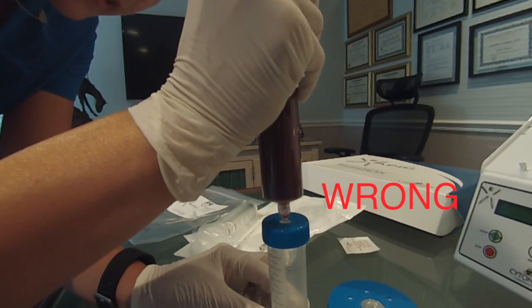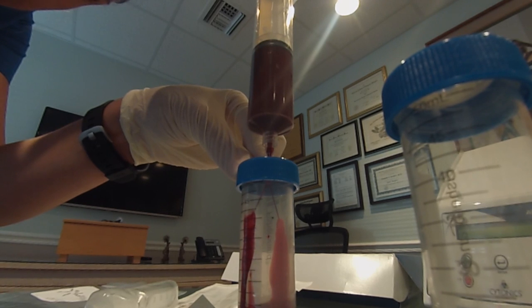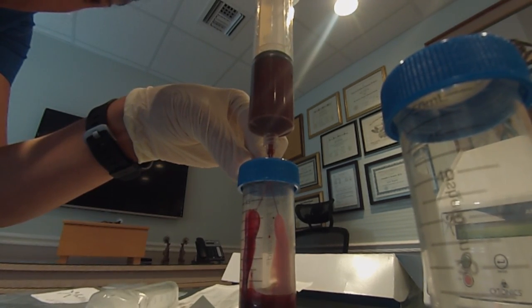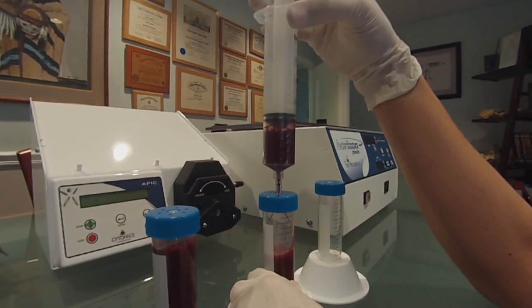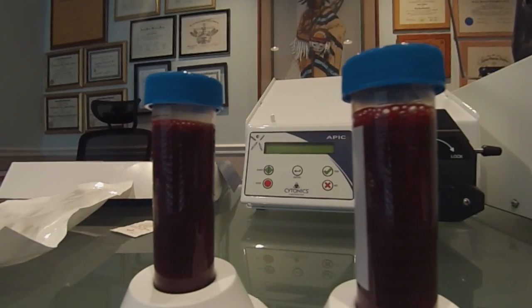Be sure not to force the cannula completely into the APIC centrifuge tube. Transfer the blood from the syringe into the centrifuge tube by pressing firmly enough to have the blood flow down the sides of the tube in a V fashion. Repeat this step for the remaining tubes, and ensure that each APIC centrifuge tube contains the same volume of blood.